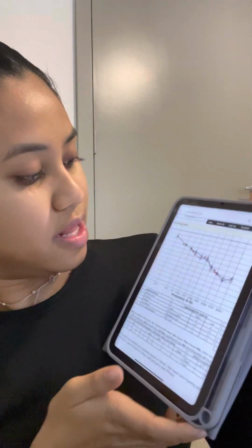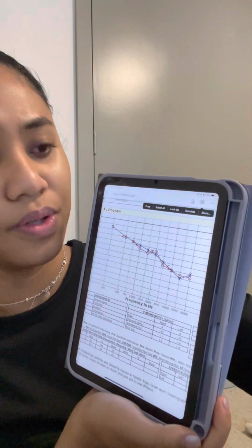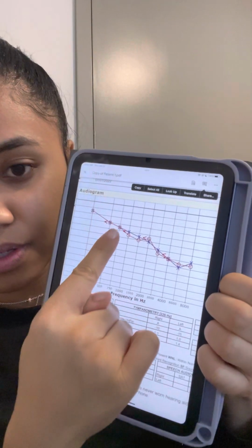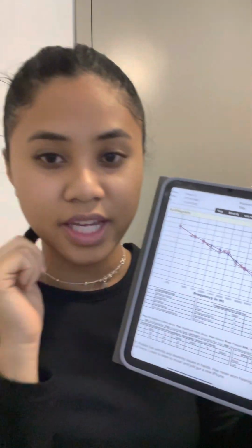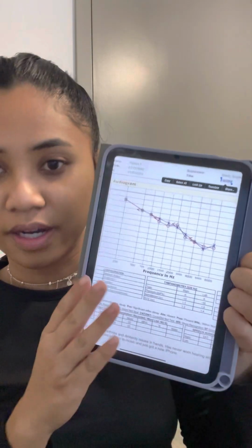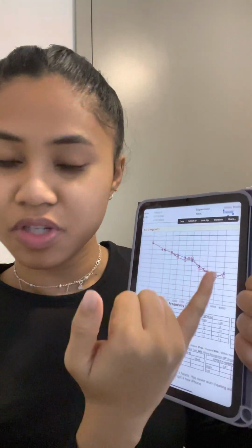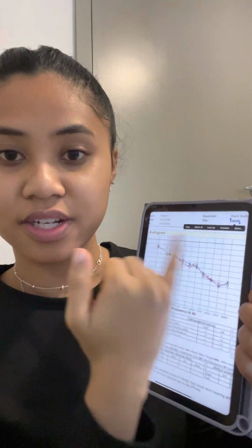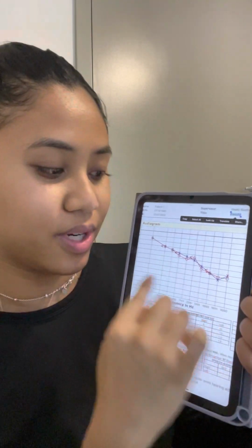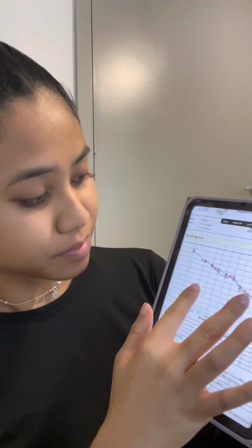And then we've also got that red connecting line, the blue connecting line. And if you look at that red and blue connecting line, this tells us that your hearing in your right and left ear are very similar to one another. In that you're able to hear a certain amount of sounds the same, but also you're kind of missing a few important sounds the same in both ears. We'll talk more on that later.